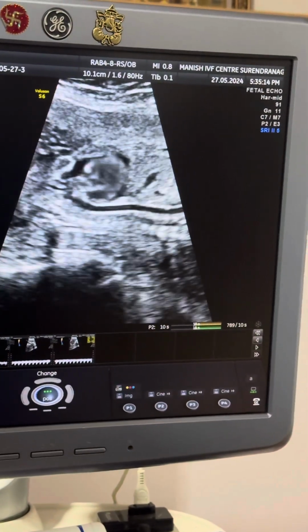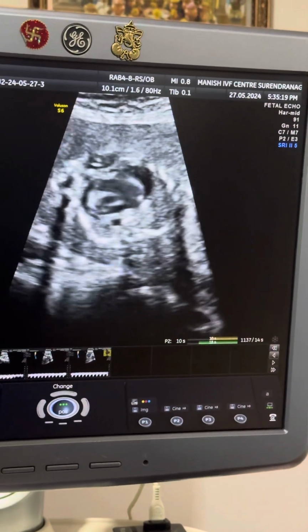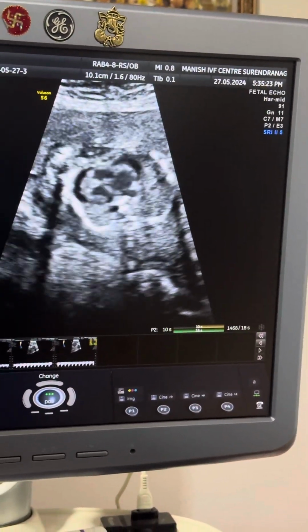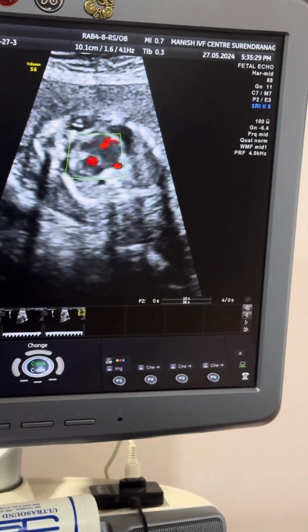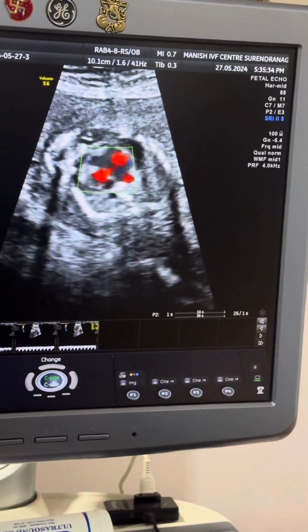Patient with severe oligohydramnios and fetus has got cardiomegaly with pericardial effusion. Here you can see 4-chamber heart in 2D. Now we will put color and you can see normal heart flowing. Both atria and both ventricles move freely. Apex to crux ventricles are seen.